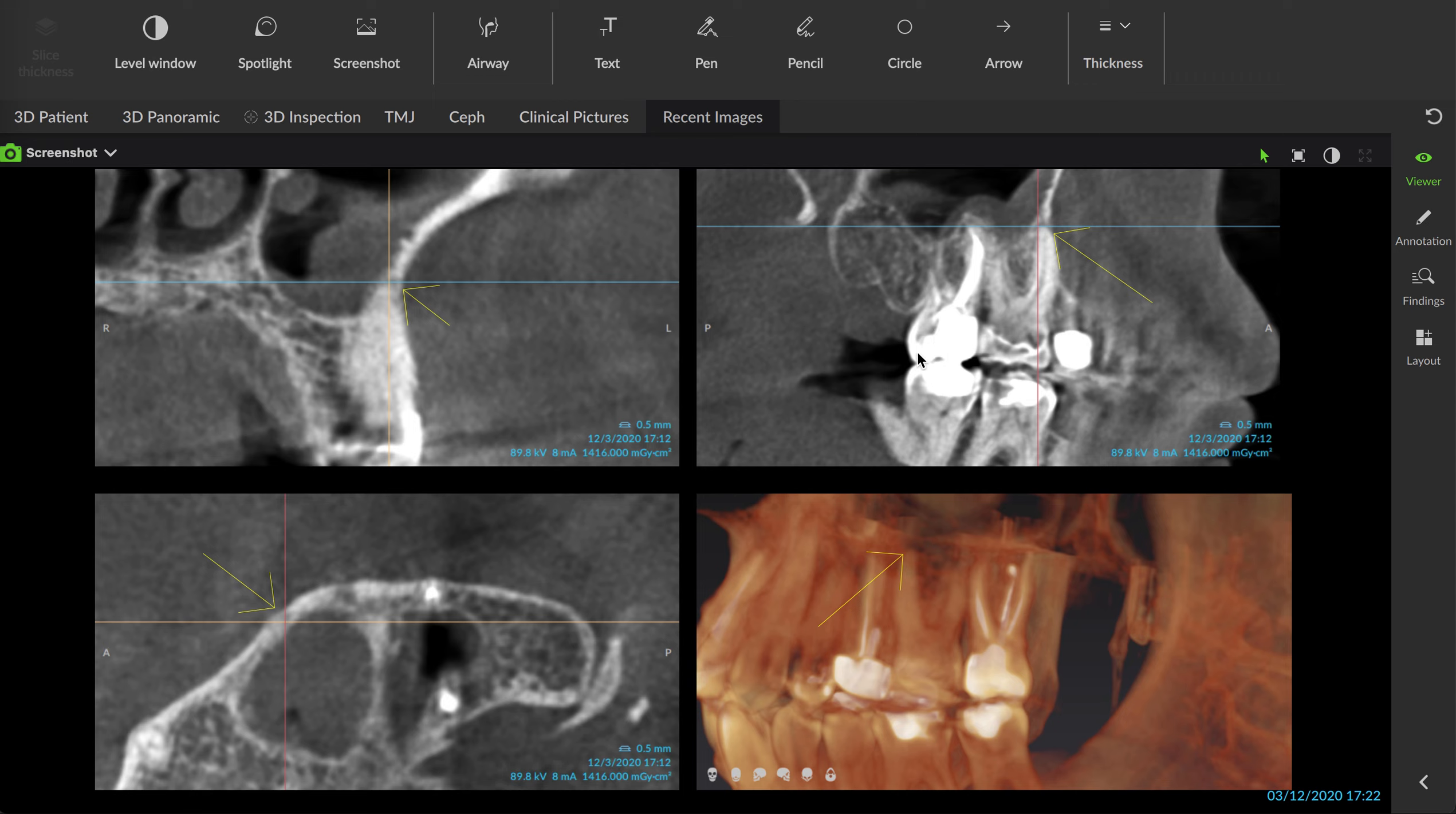Previous endo on 15 looked fine. There's a little bit of thickening in this PDL space, but when you compare this to the x-ray from last time, this is an improvement. It's a fairly recent root canal, not one done here in this office, but it looks like it was done well.